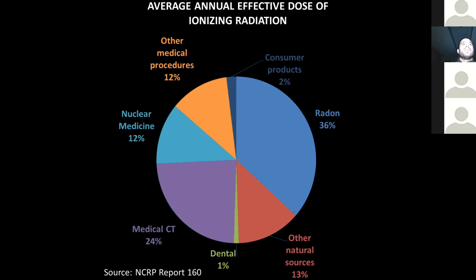The opposite end of that approach is, we want to image every patient at as high a resolution as possible, with as large a field as possible, to capture every single piece of pathology we can. That's called screening, where you're looking for things whether you know they're there or suspect they're there or not clinically. The data on that is for dental lesions, with the exception possibly of caries, where we do a risk-based screening assessment. The number of lesions you actually find by taking that high-powered imaging approach is very low. And we don't need to do it. It's not worth it in terms of dose cost, financial cost, time cost, any sort of measure for those patients. So I really stick to this: you have a reason to take the scan, you match the image quality to it, and go from there.